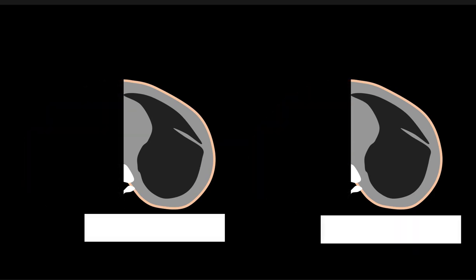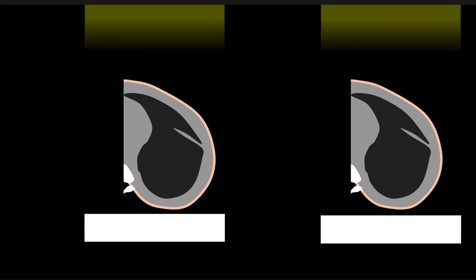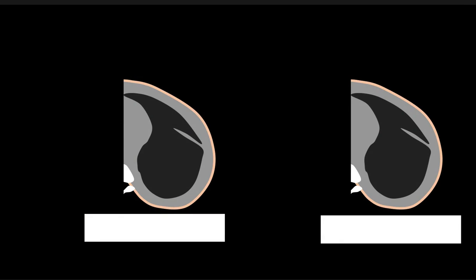I'm going to put the film behind the patient, and I'm going to pass some x-rays through. And we're going to see what happens slice by slice. So bring the center of this up here. Now I'm going to give one of these patients a pneumothorax, and I'm going to give the other one a big skin fold. All right, so let's do that. So he gets a pneumothorax there, and this other guy's got a skin fold right there with the red arrow. All right, see that? So pneumo, skin fold.